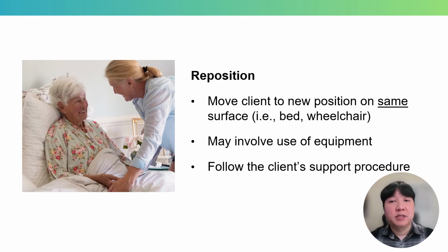Repositioning is defined as moving to a new position on the same surface. For example, when we shift in bed from our back to our side, that is considered repositioning. If clients need help repositioning, this may include the use of equipment such as a bed rail to get into an upright position on the bed. Again, their specific needs will be in their support procedure, so please read and follow the client support procedure.